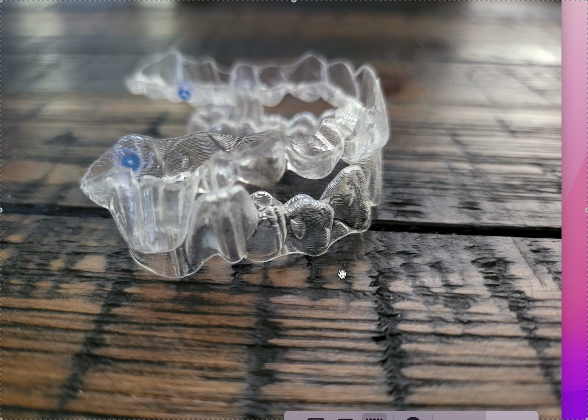Invisalign with MA is only going to work if the patient is growing. If the patient is done growing, not gonna work. So first of all, you need to pick the right patient. It is not Invisalign's job to know if your patient is still growing. They don't know.